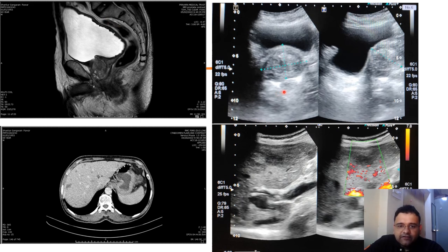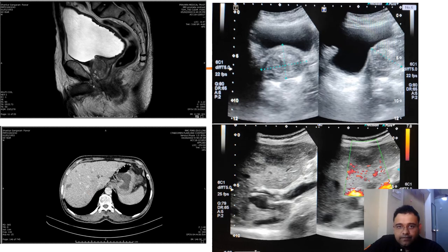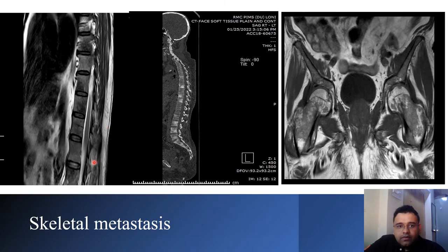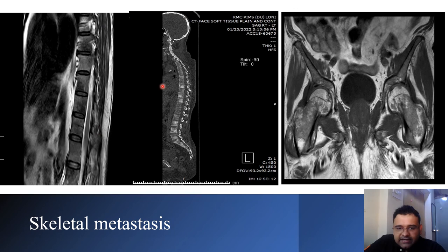Ultrasound correlation of the same patient was shown. The patient had PSA of more than 100 and had skeletal, hepatic, and brain parenchymal metastasis. CT sections and corresponding ultrasound sections showed hepatic metastasis. On T2 weighted sagittal images of the spine, multiple hypointense areas were obtained. CT sections confirmed extensive skeletal metastasis throughout the vertebral column, and the patient also had metastasis in the femoral region.